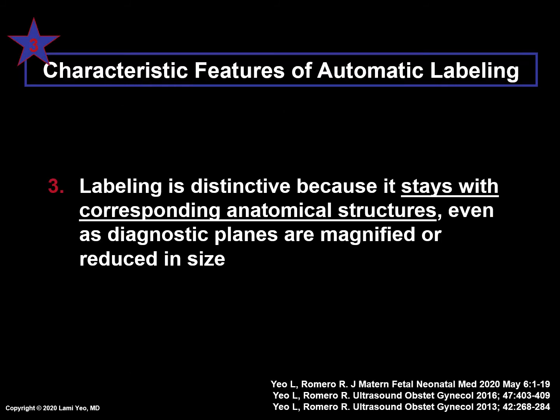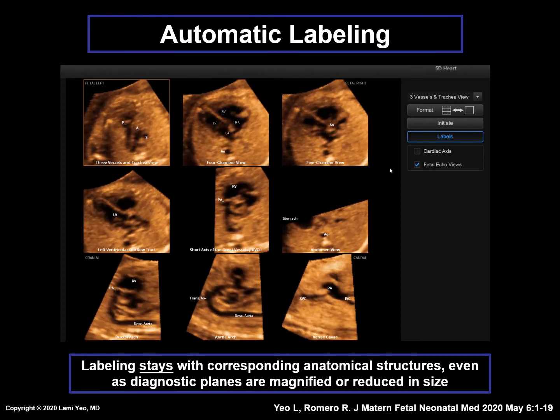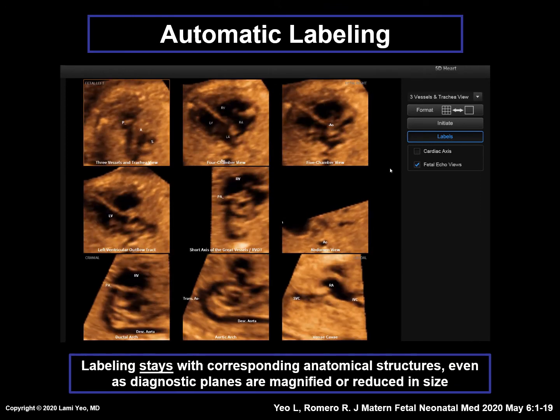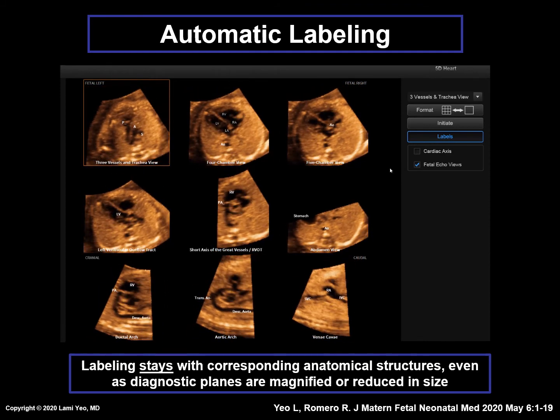The third characteristic feature of automatic labeling is that it stays with the corresponding anatomical structures even as the diagnostic planes are magnified or reduced in size. This is because labeling is essentially married to the anatomical structures. Please notice how the labeling always stays with the structures in this video clip.